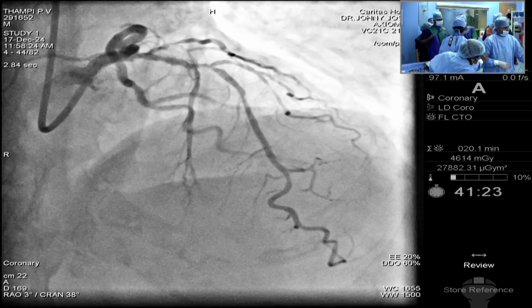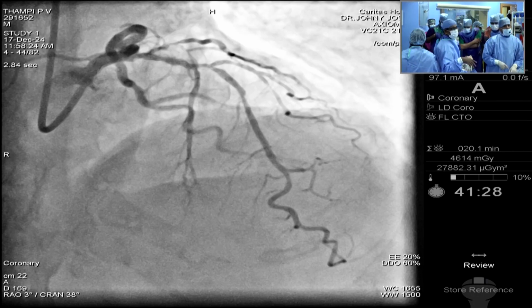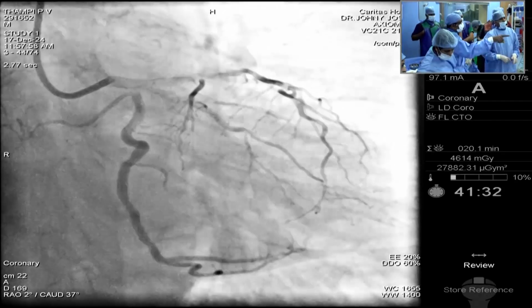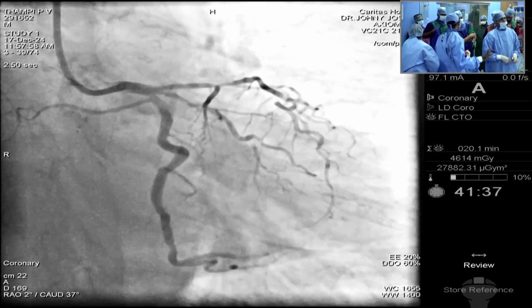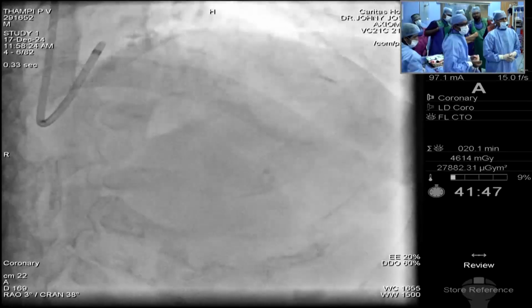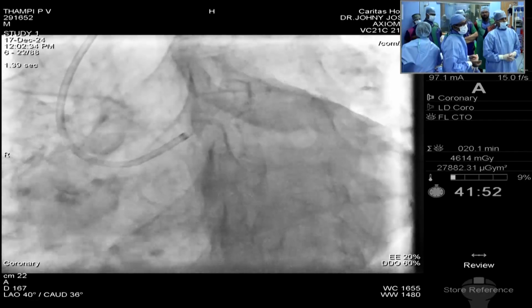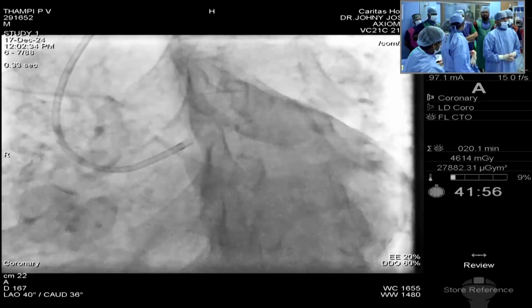Yeah. This view is probably again the left main. Come to the previous view. Show the previous view also. Here again you have a reasonable landing zone. There is no significant plaque at the left main LAD ostium. So covering the left main may not be needed in this particular case. Spider. Next view. Do we have a next? That's the cranial view. Next view. You can always have a reasonable landing over there.